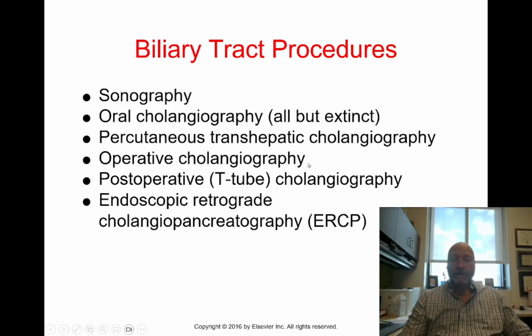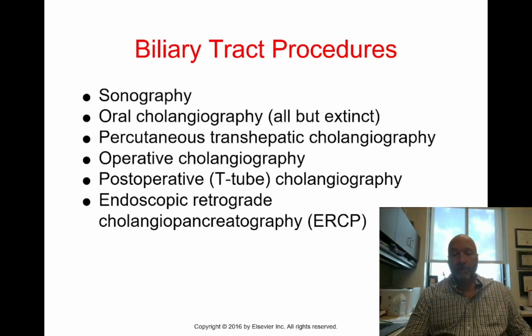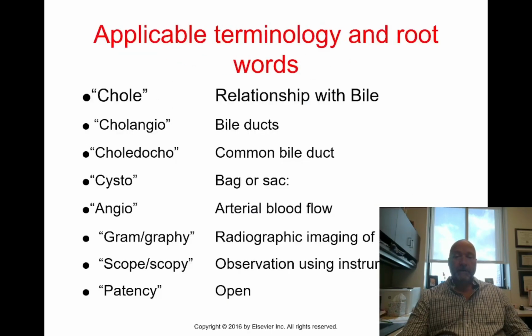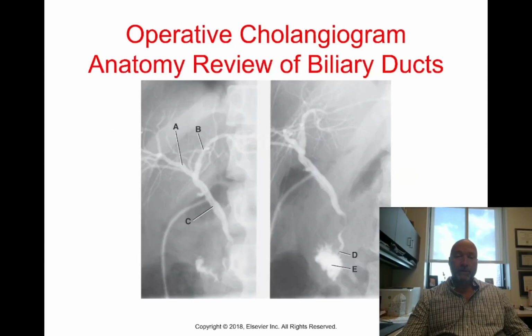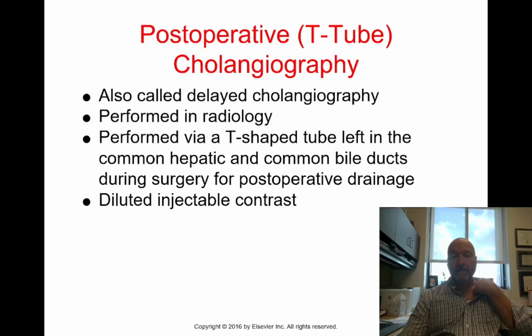If you do any kind of cholangiography in surgery, that is operative cholangiogram, even if they are pushing through the T-tube. Post-operative T-tube cholangiograms are maybe 2-3 days after the patient had surgery. The patient comes down to the x-ray department, and we'll inject that T-tube again and look and see if the stones are gone, or if the contrast goes all the way down into the duodenum. So T-tube cholangiogram, that's operative cholangiogram, percutaneous, post-operative. There we go.